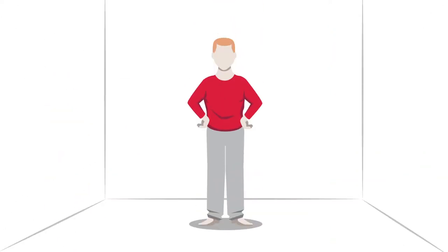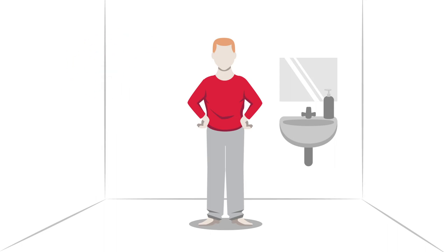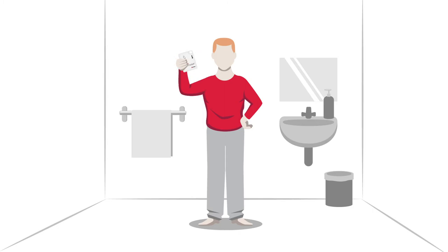Now let's start. Make sure to have the following items prepared. Soap and water to wash your hands and the urethral opening, or, if required, non-alcoholic wet wipes for urethral cleansing. This will depend on your healthcare professional's instructions. Towel and waste bin. And last but not least, your VaPro Plus pocket catheter.